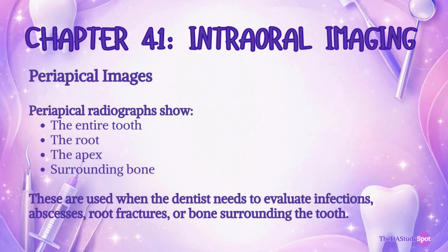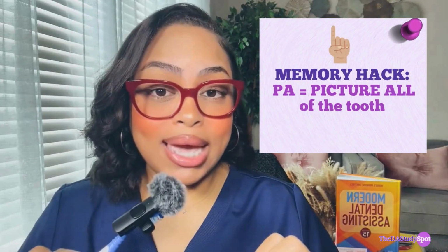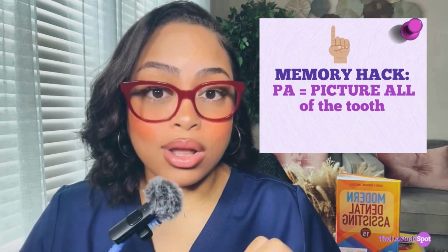First up, periapical images. Periapical radiographs show the entire tooth, the root, the apex, and the surrounding bone. These are used when the dentist needs to evaluate infections, abscesses, root fractures, or bone surrounding the tooth. Memory hack. PA stands for picture all of the tooth.